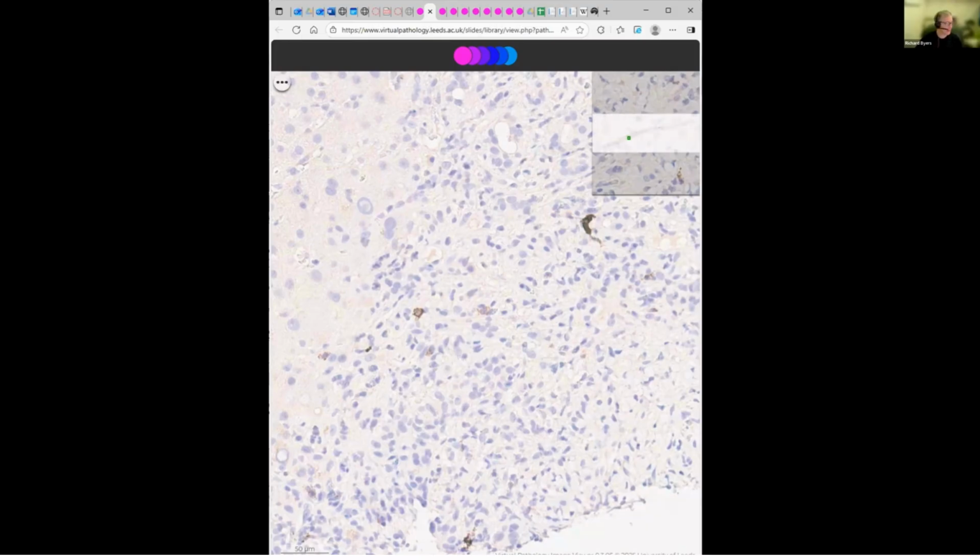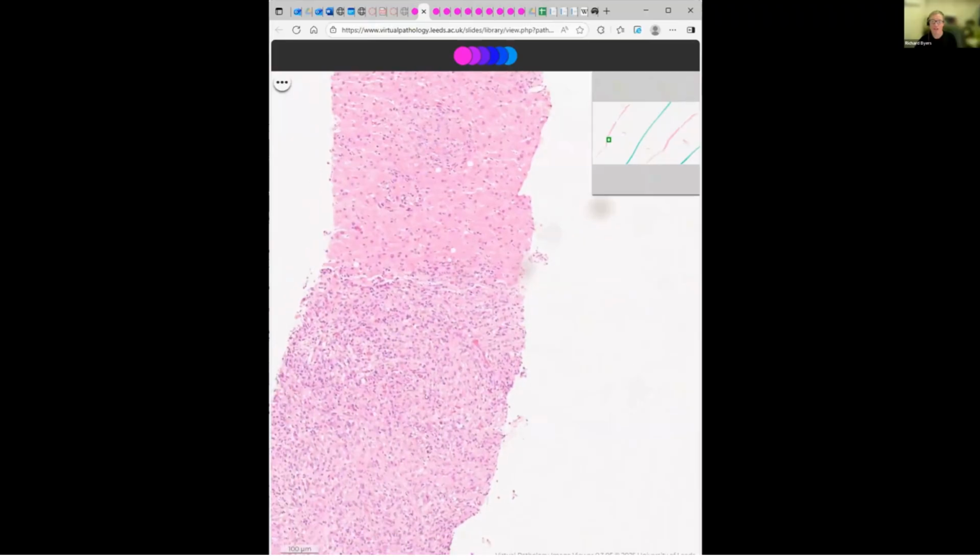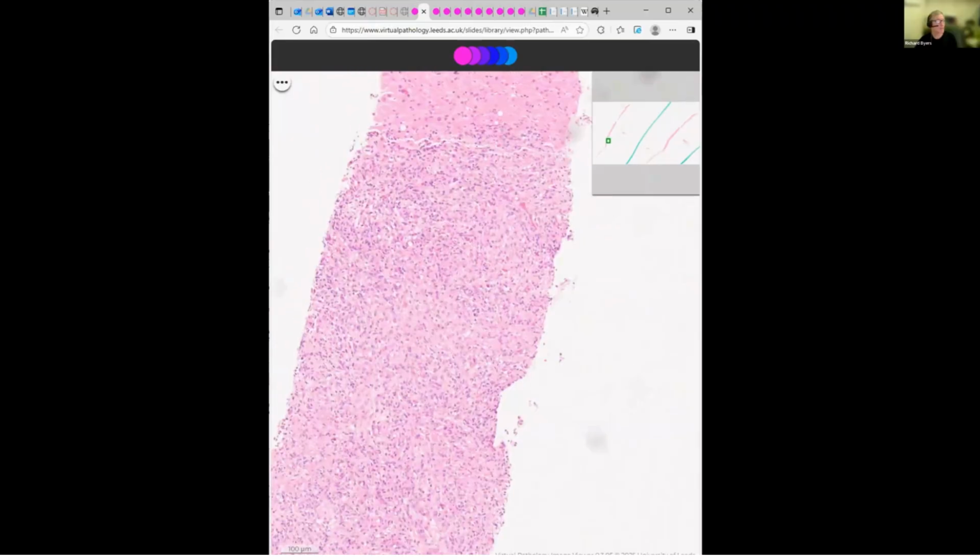Okay, well, we spent quite a lot of time on that case. Are there any more questions from that case, which I think is a really interesting case? And I must confess that when I saw the H&E, which is here, Hodgkin's actually wasn't on the top of my list. So Venkatesh, congratulations, that's a very good suggestion. But also, thank you for suggesting Langerhans cell histiocytosis, because in a case like this, it's really important to have a wide differential and think what immunos am I going to use to sort it out.